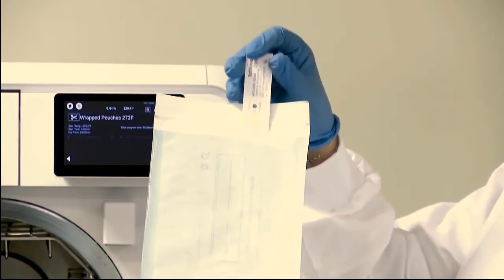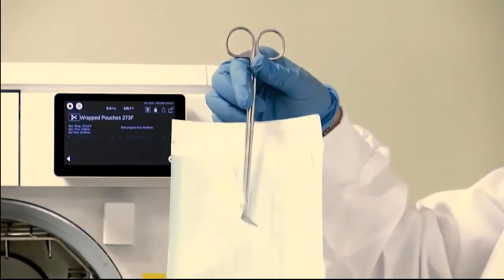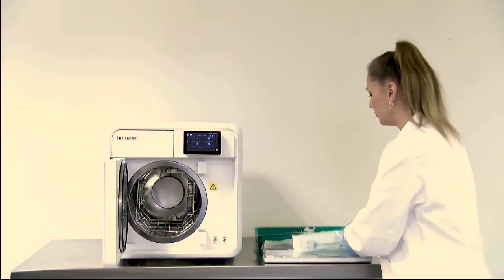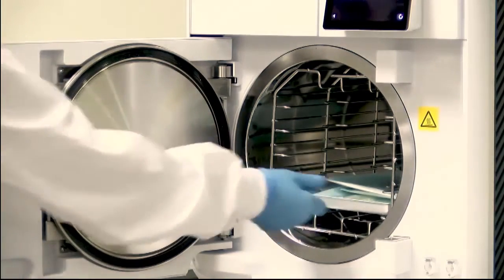When preparing a wrapped load, place the required equipment on the sterilization pouch and include the control chemical indicator in the pouch. Then place the equipment on the T-Edge dedicated trays and insert the trays into the chamber.